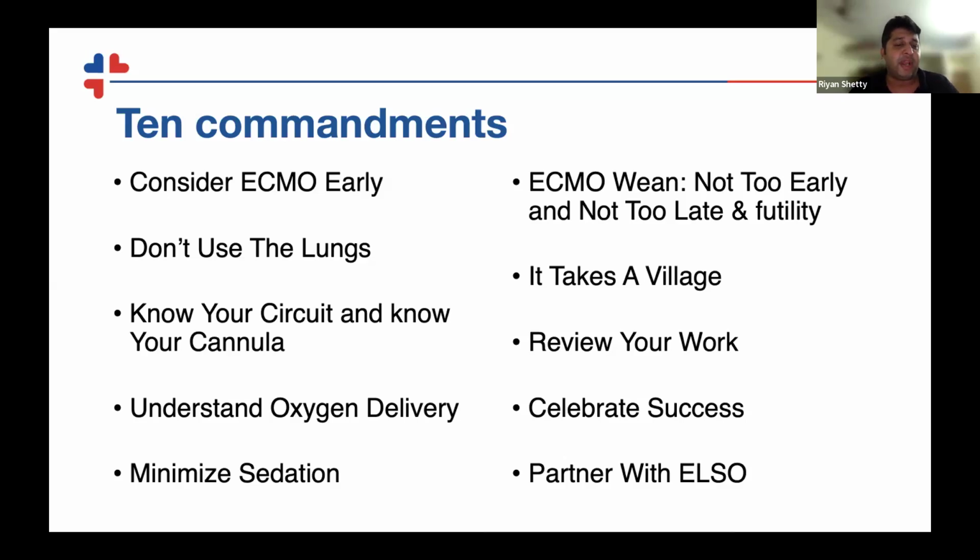Understand the oxygen delivery, like I mentioned. Minimize sedation. Think about taking the tube out. Think about extubation. Think about walking. Think about exercising on ECMO. Think about yoga on ECMO. Think about music on ECMO. So minimize sedation. ECMO wean not too early, not too late, and always recognize futility and back off.